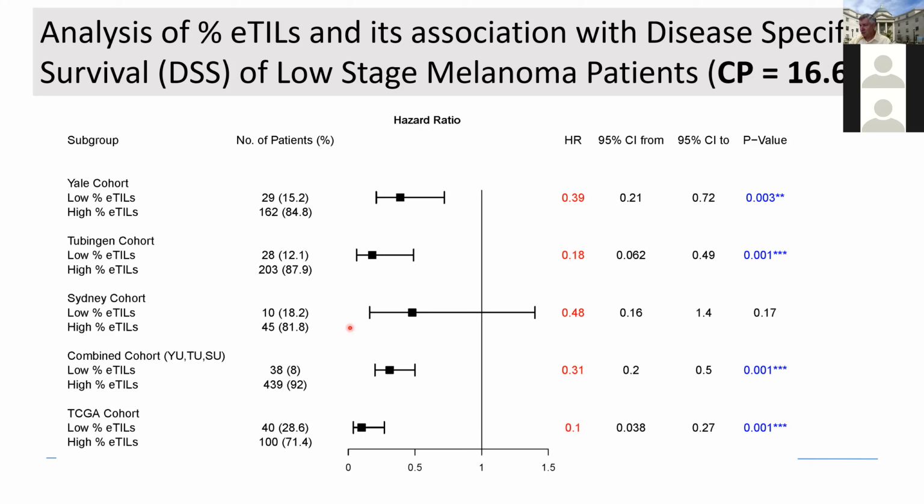And so this validates, and we're hopeful that this could potentially be used in the future in a prospective trial to try to select melanoma patients for either treatment or non-treatment in the adjuvant setting with immunotherapy.